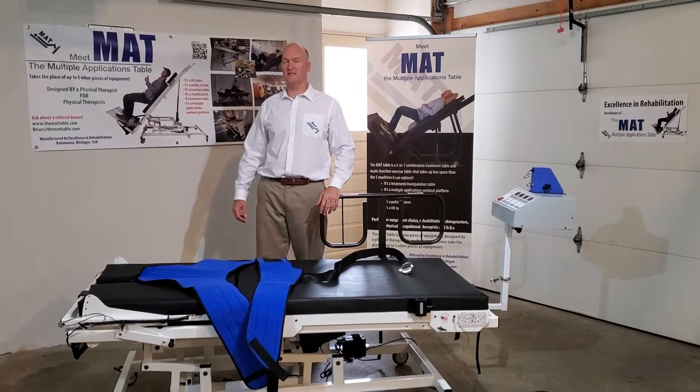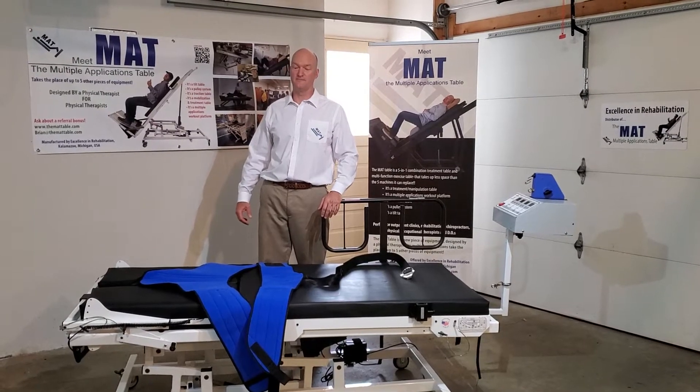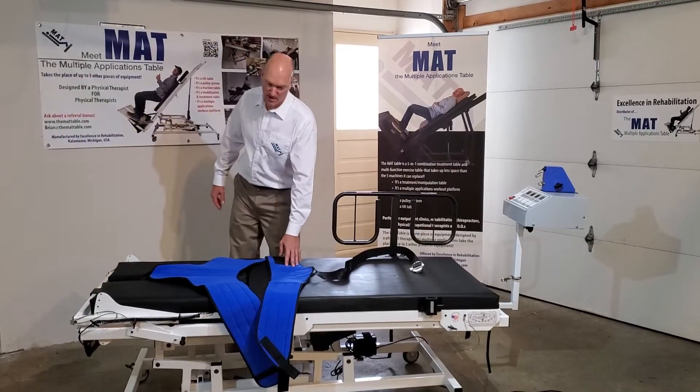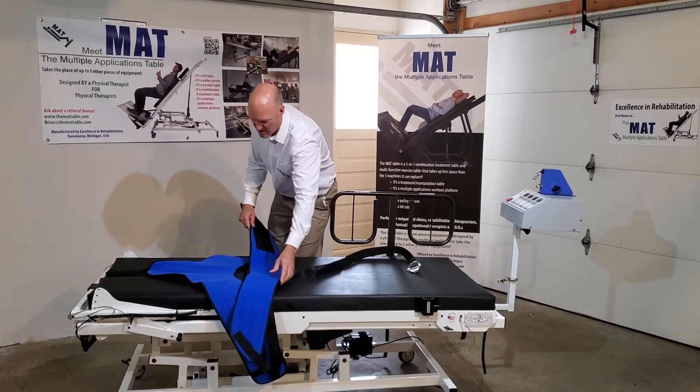Today we're going to demonstrate how to set up lumbar traction on the multiple applications table. First you have to set up your belts. You have the thoracic stabilizing belt and the lumbar belt which will apply the traction load.